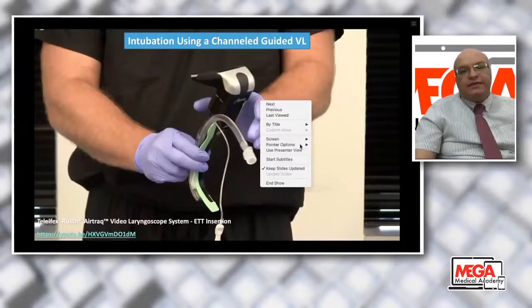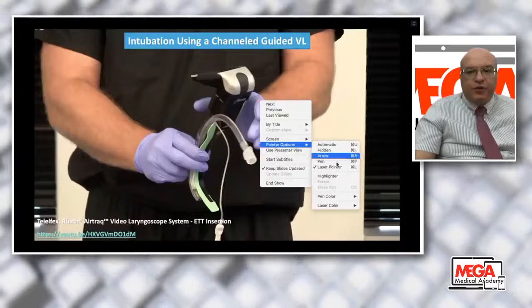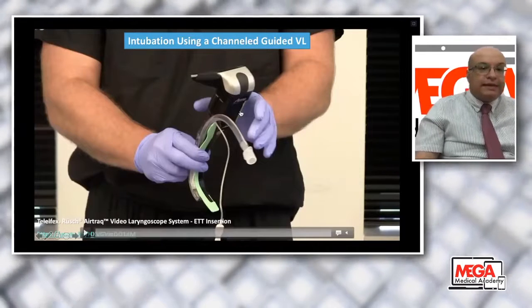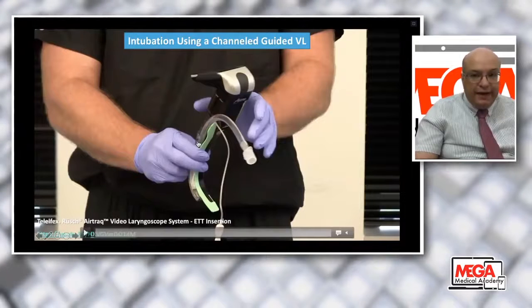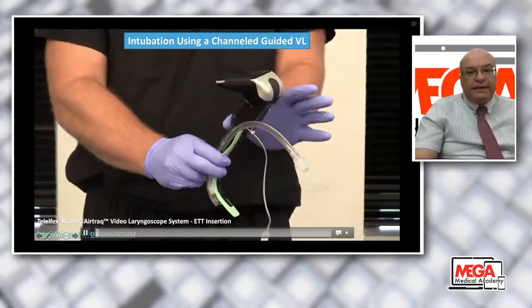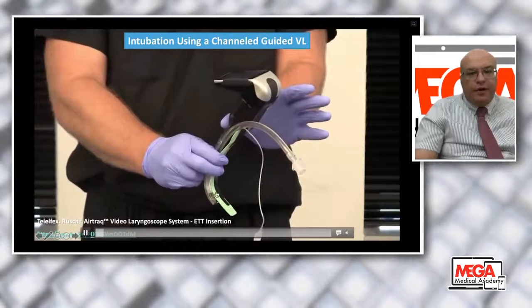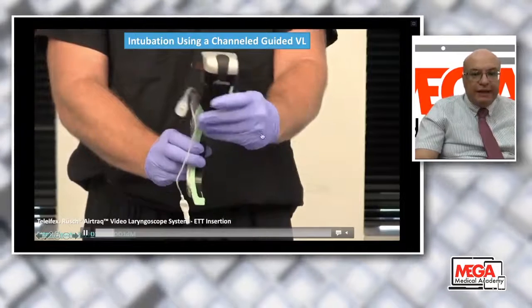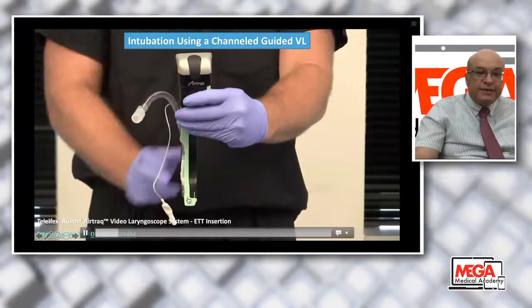Here in this video demonstration, I'll show you how to use any type of video laryngoscope, with the AirTrack as an example. You have first to lubricate the tube and lubricate the tip of the video laryngoscope. Insert the tube through the channel. Turn the light source on.